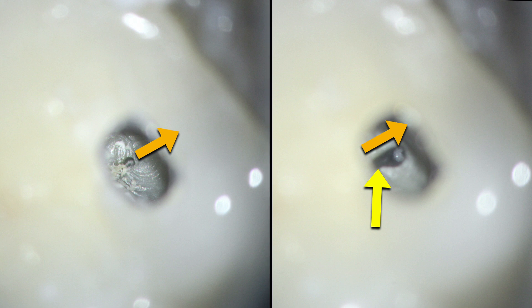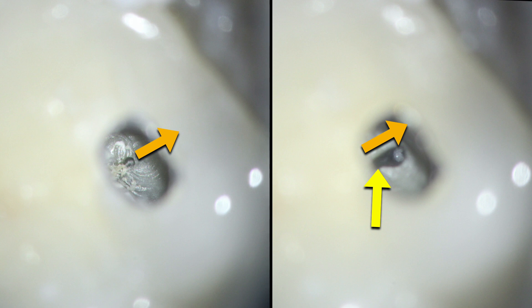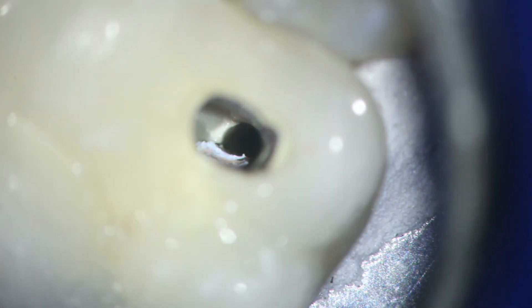This is after the orifice has been opened. When we compare side by side, the MB2 initially appears as just a little spot, but after opening the orifice, we can see it has been moved further underneath the mesial marginal ridge. The way it branches from the pulp chamber proper is extremely acute. So we have to translocate that orifice underneath the mesial marginal ridge, otherwise we'll have a very difficult time obtaining length on this root system. The yellow arrow identifies where the orifice used to be, and the orange arrow represents where the orifice has been translocated in order to remove constrictive dentin for better access to treat this root canal system efficiently.